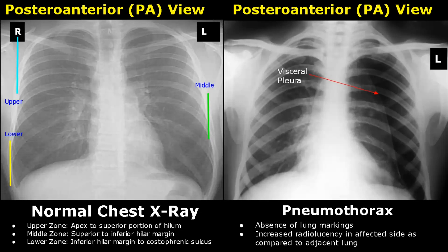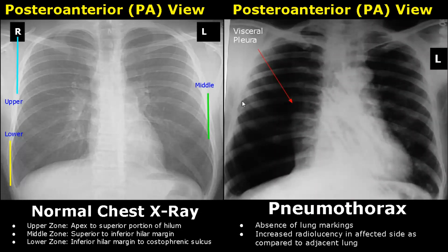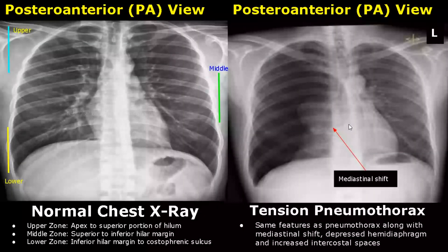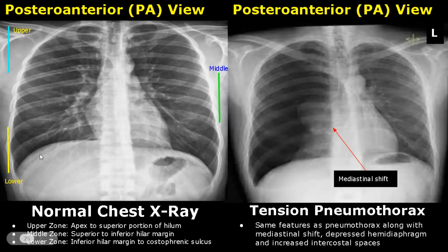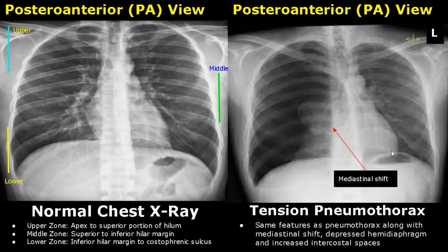Here is another image of a right-sided pneumothorax. A tension pneumothorax will have additional features such as a mediastinal shift and a depressed hemi-diaphragm. Normally the right hemi-diaphragm is slightly higher than the left because of the liver, but here you can see it is actually a bit lower than the left hemi-diaphragm.